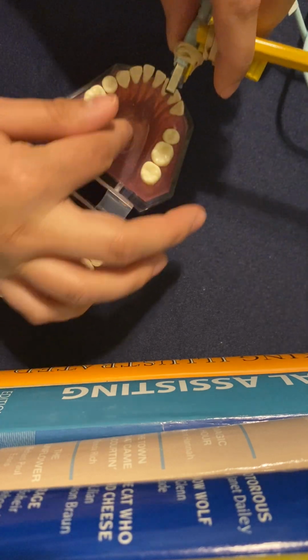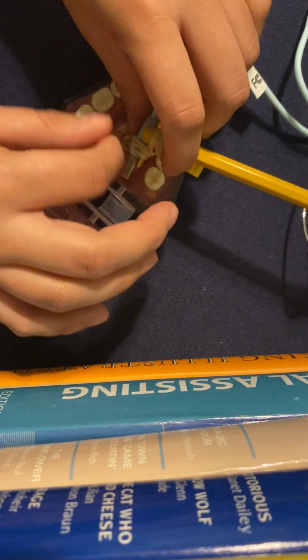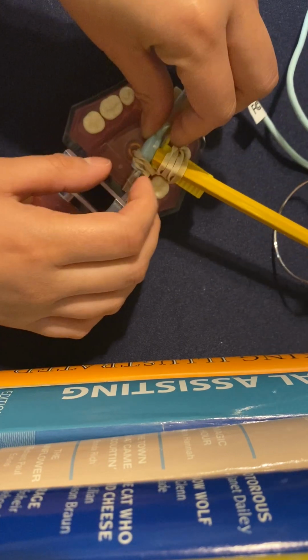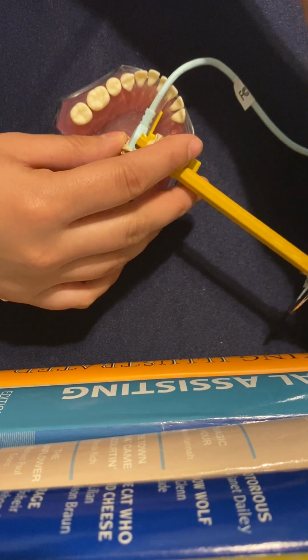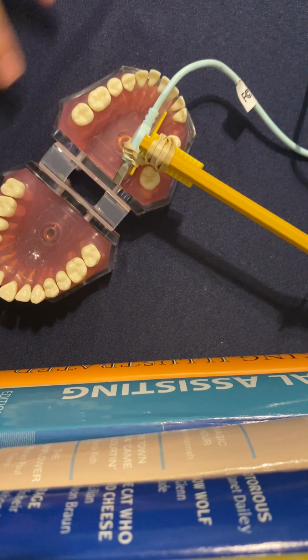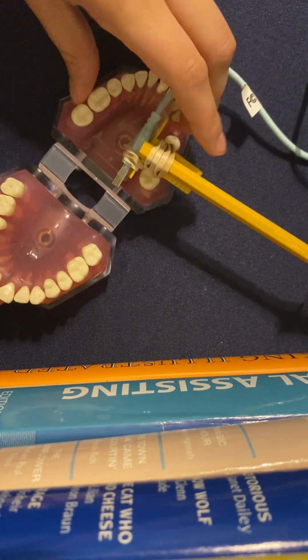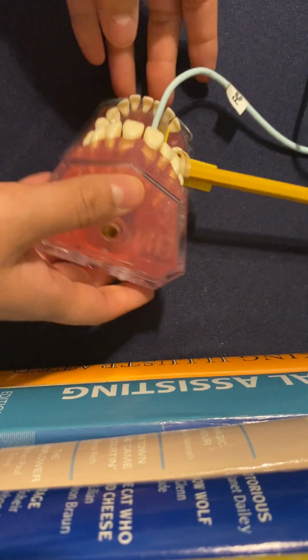So, like I said, midline. You're going to want to push the tongue over a little bit for these, but you don't want to gag them. Like I said, put it on their tongue if it's that uncomfortable, but we try to avoid doing that. And the teeth that you're going to want to see in this one are the first, second, third molar, crown, and apices. So, right down.